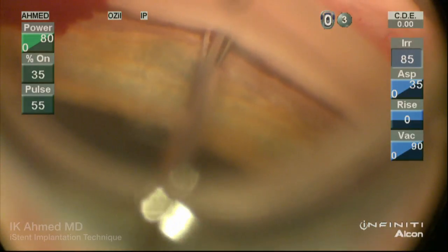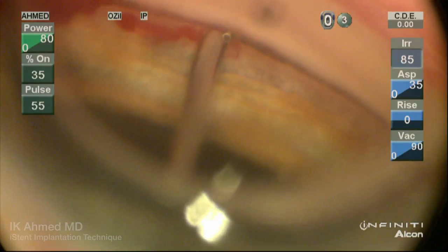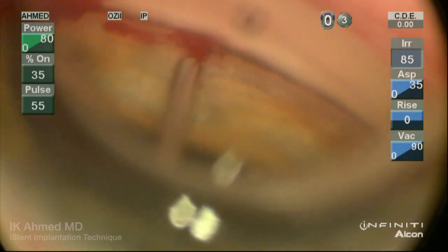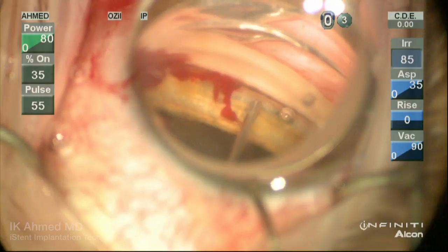The snorkel is then released from the implanter gently, and the tip is used to push the snorkel against the outer wall and tap the device to ensure it is well seated. It's important that the elbow of the device is placed fully within the canal itself.